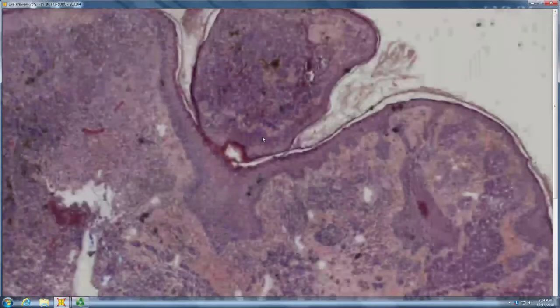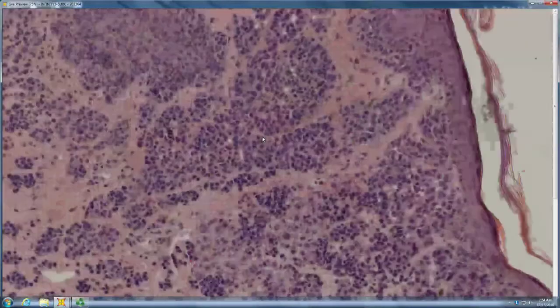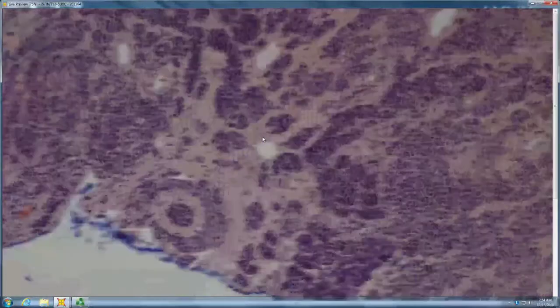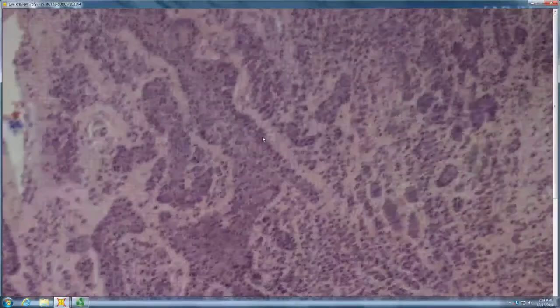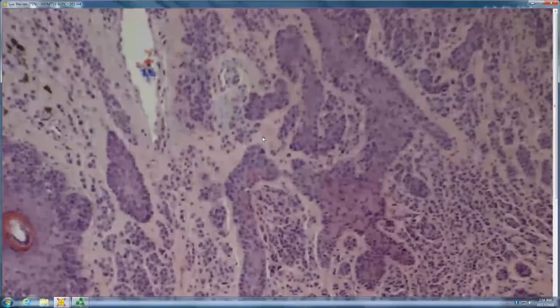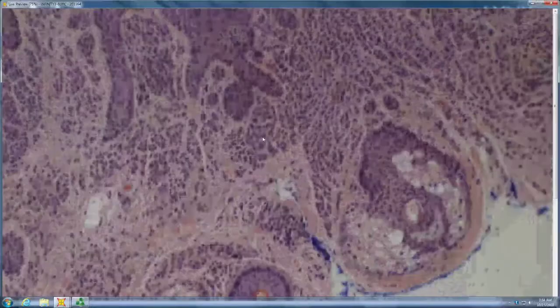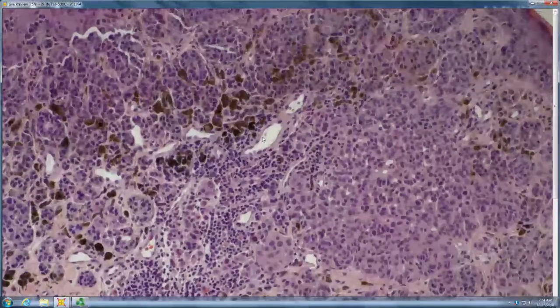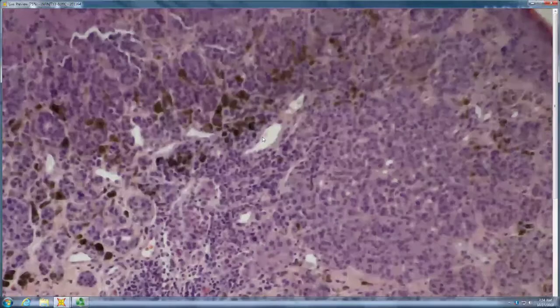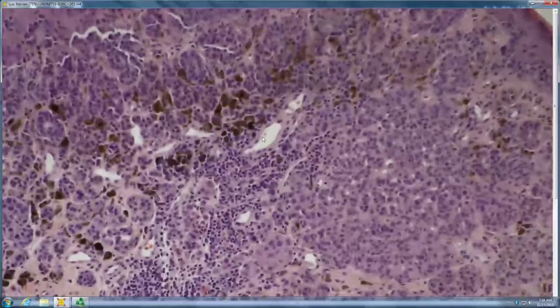It's a melanocytic proliferation. It goes pretty high up. Trying to see if it matures down. That area looks like it matures pretty good to me. That area looks like it matures. How about this area? That area scares me a little bit. That area should scare you a lot. So maybe a melanoma and a nevus. That's exactly what it is: melanoma arising in a nevus.